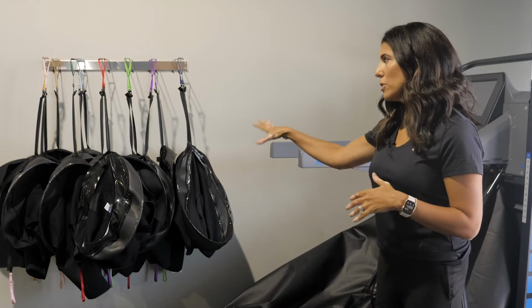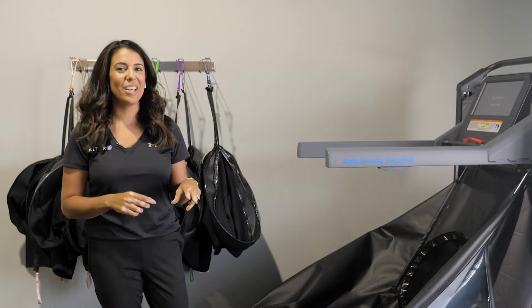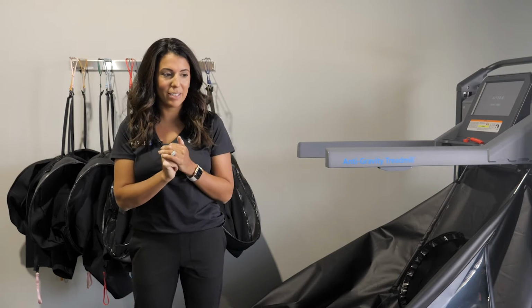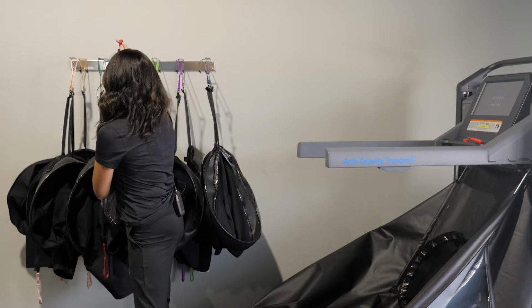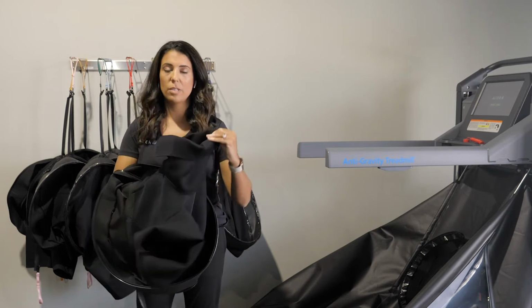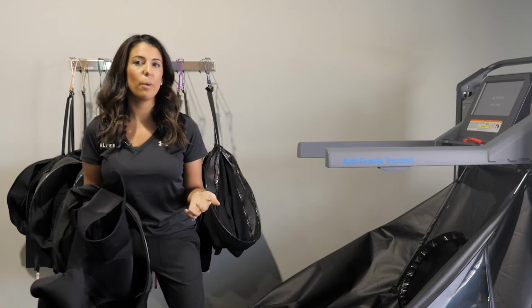What we're going to do first is talk about the shorts. The shorts come in a variety of sizes, all the way from XXS up to quadruple XL. So there really isn't a patient that can't fit into the shorts. And for the outliers, we have ways to work around that. The shorts should be snug, but not overly tight. They're made out of just a neoprene fabric, and they're to be worn over athletic shorts or some other apparel.